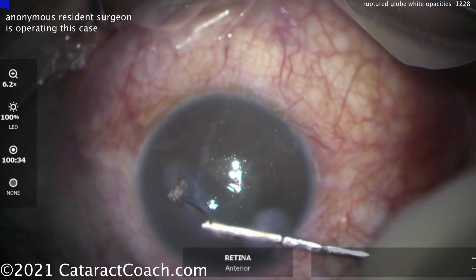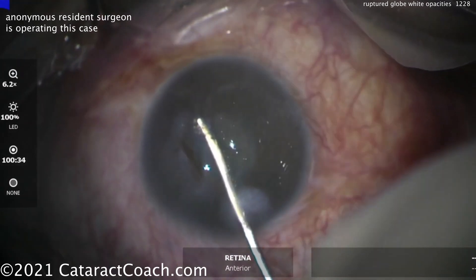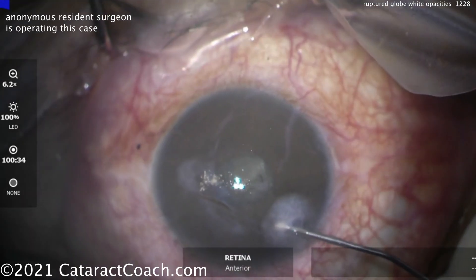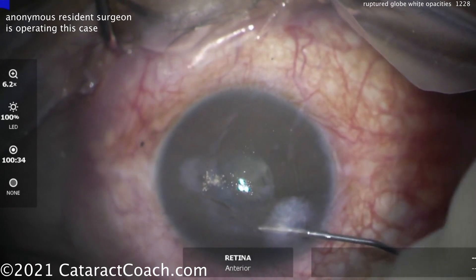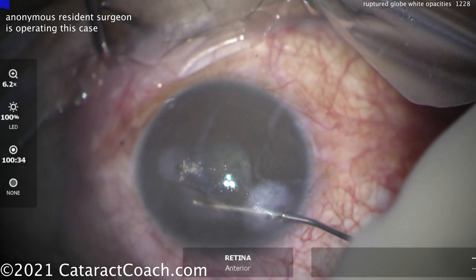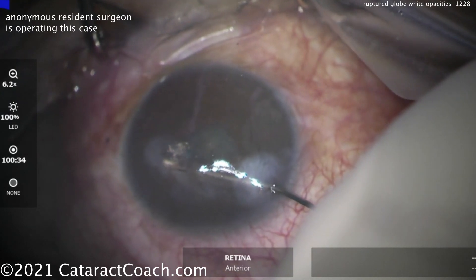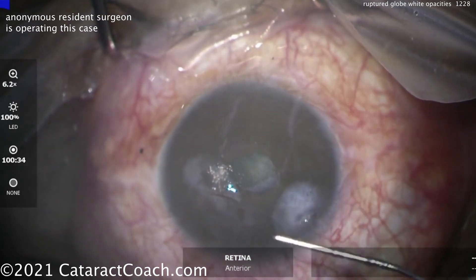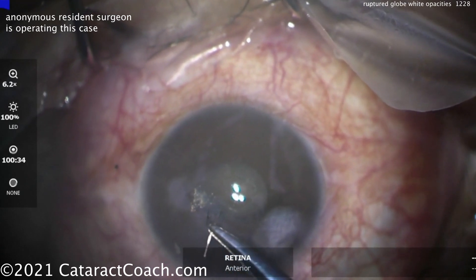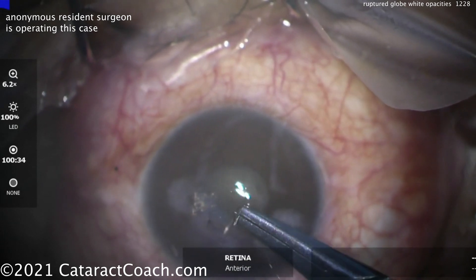Coming in here, you can use a spatula and sweep the vitreous back. This patient is going to need much more surgery. The resident's job is to close the laceration, and our retina fellow is here to do a vitrectomy. This patient had an intraocular foreign body from the gardening accident — it's in the vitreous. The laceration affected the cornea, the foreign body went through the iris, damaged the lens and lens capsule, passed through the vitreous, and is now lodged in the retina.